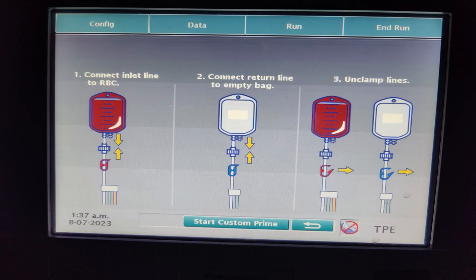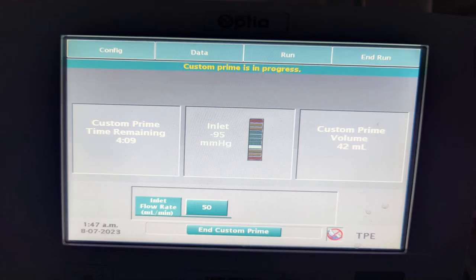Now we press the start custom prime key. Once the custom prime has begun, the system will show us how much time is remaining, how much volume of custom prime is being delivered at the moment, and what inlet flow rate we have set.